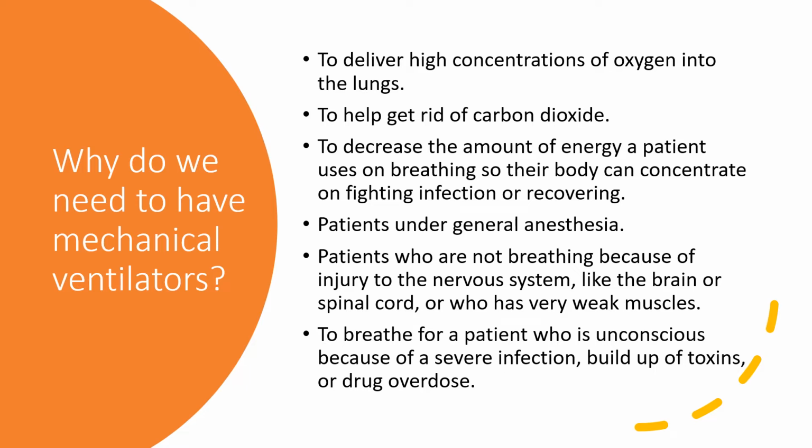They cannot ventilate properly, so a lot of times they're put on mechanical ventilation at night, and there are some cases where they're on it 24/7. It all depends on the severity of the illness. Other cases of using mechanical ventilation: if someone becomes unconscious due to severe infection, building up toxins, drug overdose, cardiac arrest, any of those patients who cannot breathe benefit from mechanical ventilation.